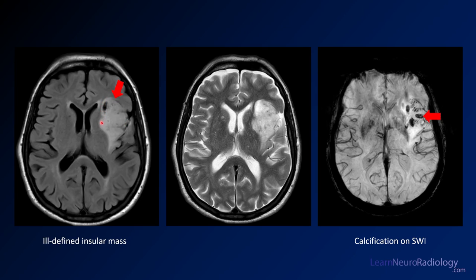Here you see the lesion — a mass in the left insula. It's ill-defined, involving the cortex all the way through. On T2 you see a similar appearance. On SWI, you see areas of hypointensity — those are areas of internal calcification. A CT might also show calcification, but SWI is great for seeing those.